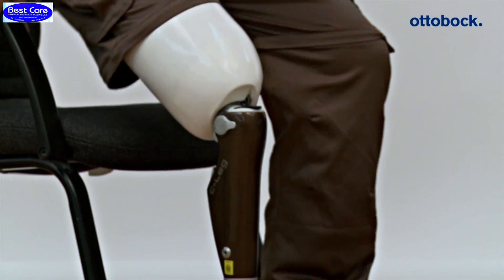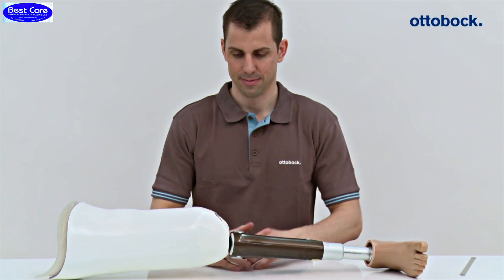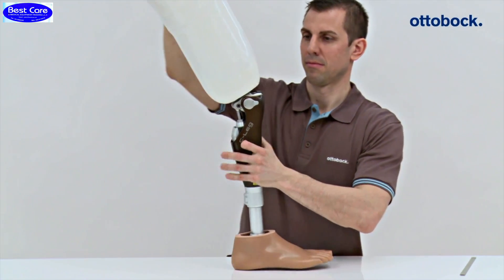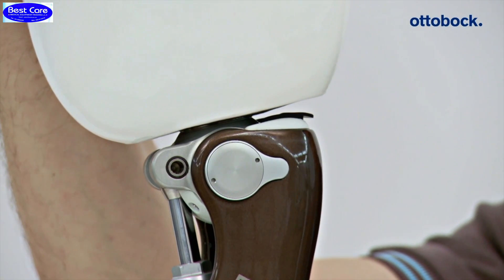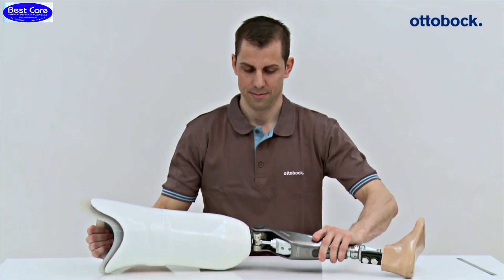Particular caution is required when a C-Leg from a previous generation is replaced with a C-Leg 4. Due to the additional extension potential of the C-Leg 4, switching the knee joints could result in contact between the socket and main electronics even when there was sufficient distance with a previous fitting. This is particularly important during trial fittings.